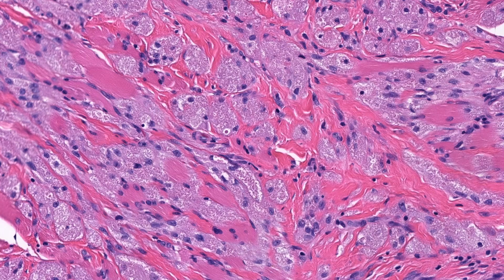But I would order an S100 and/or SOX10 to confirm. And what a surprise! This is indeed an example of a granular cell tumor, a largely benign tumor thought to be of Schwannian origin. It can occur in a wide variety of locations, including skin and soft tissue, oral mucosa, and less commonly visceral sites.